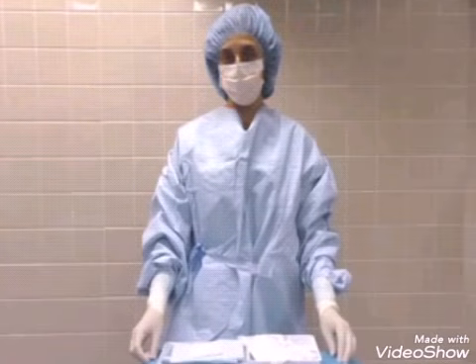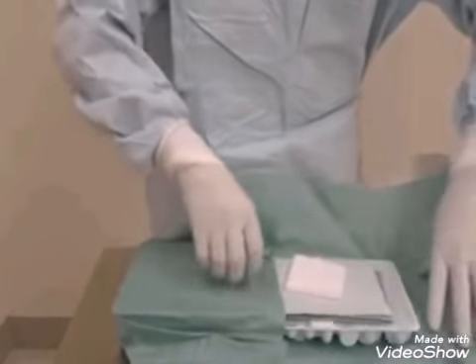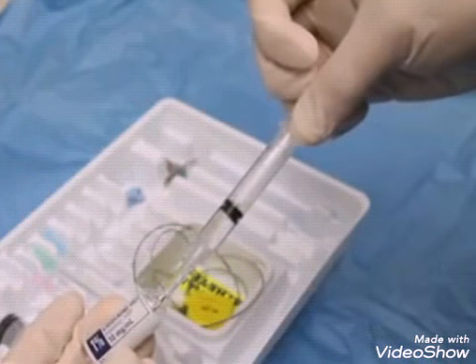Sterile technique is very important for this procedure. Don a mask, head covering, and sterile gloves. Adhere to the policy of your institution regarding a full sterile gown. The patient and anyone else in the room should also wear a head covering and mask. Open the sterile epidural kit and organize the contents so that you can readily find and use the equipment as needed. Use the filter needle to draw up the medications.